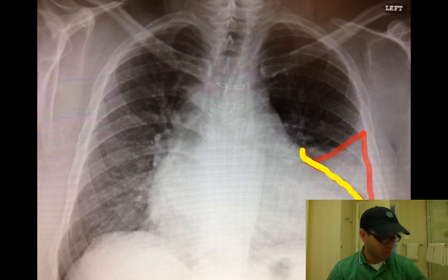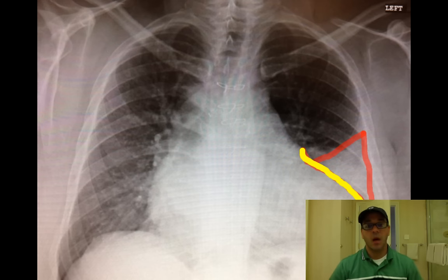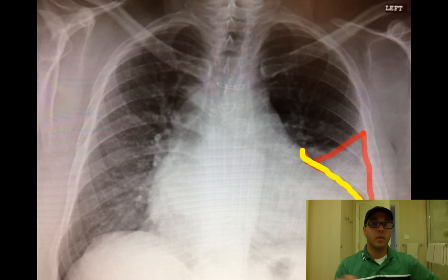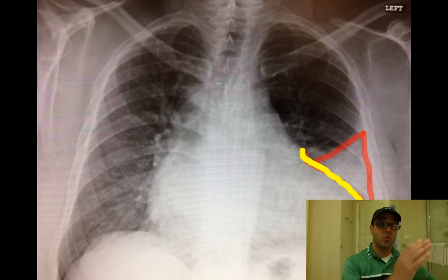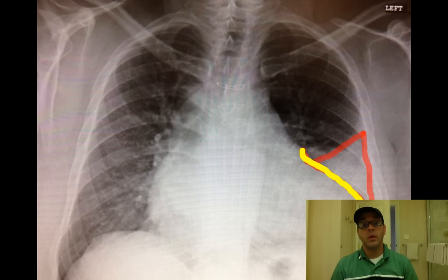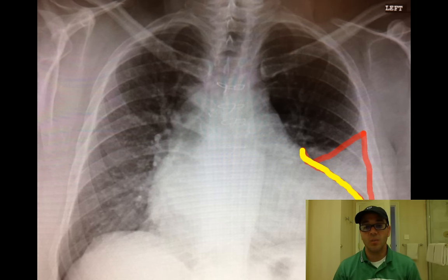You can see the red triangle — that's an area of density that should look black, like the upper part of the lung or the right side of the lung, which looks uniform throughout. That area is either fluid, pneumonia, or atelectasis. In this particular case, the patient had a fever and a cough, so the diagnosis is pneumonia.